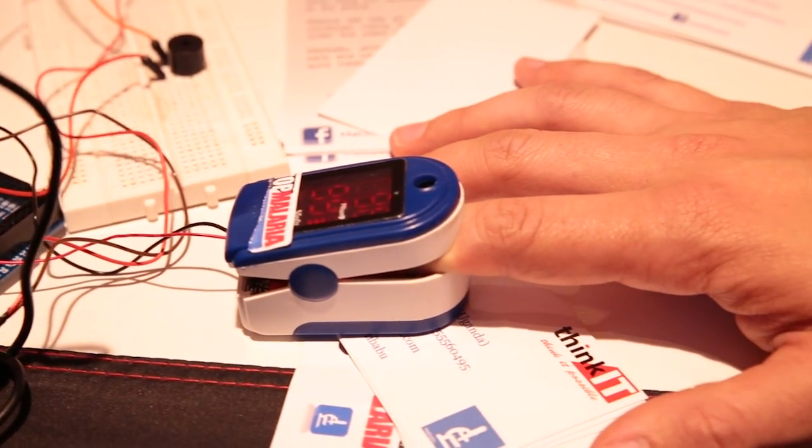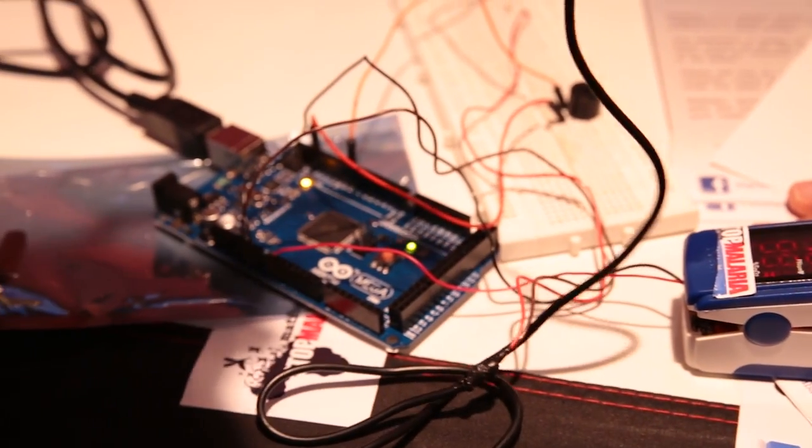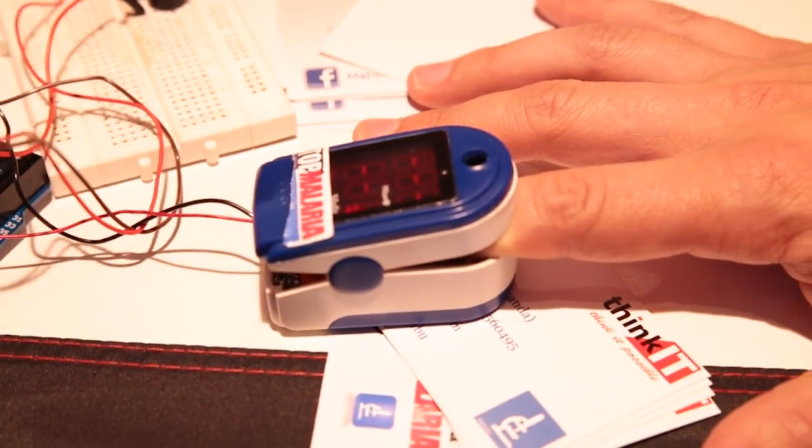All you need is such a small device. Though this is still a prototype, that's why you see the Arduino board around it. And so why are you using a light sensor? What happens when I put my finger in here? The red blood cell is biconcave, and when it's affected by the malaria plasmodium, it affects the light scattering properties. So if I put red light through your finger at different wavelengths, I'm able to pick up intensities of the red blood cell.